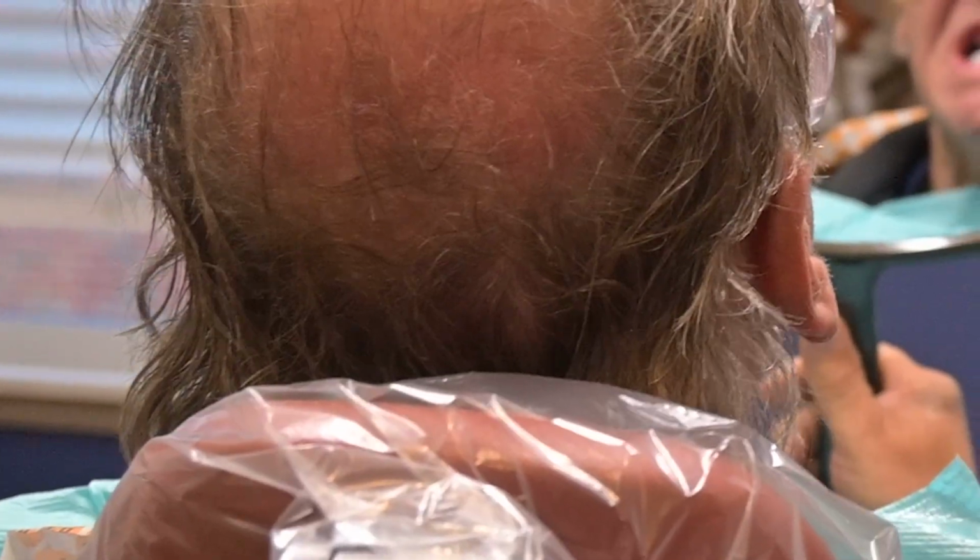After the implants integrate, they're going to be able to eat whatever they want, of course. We just ask them to take it a little bit easy with this provisional because we don't want to damage any of the integration of the implants.